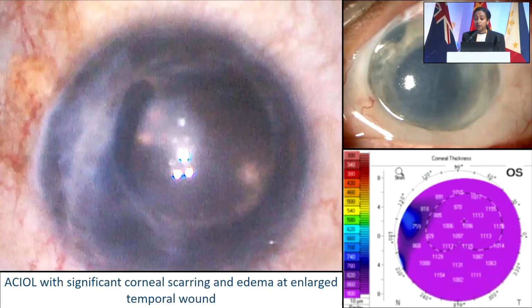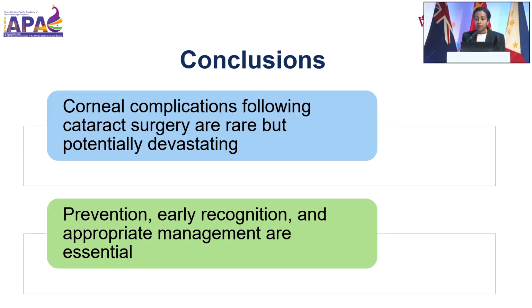This was a patient that was referred to me after anterior chamber intraocular lens placement. You can see the trauma at the surgical wound, which was enlarged to accommodate the ACIOL. There is significant scarring and edema, and you can see on tomography the corneal thickness is over 1,000. This can be difficult to treat, and so again, preventing this is essential.